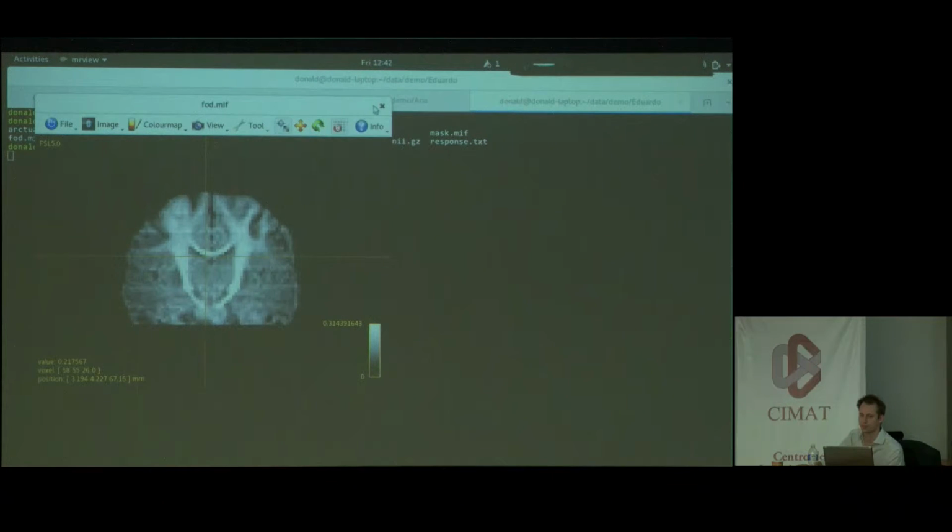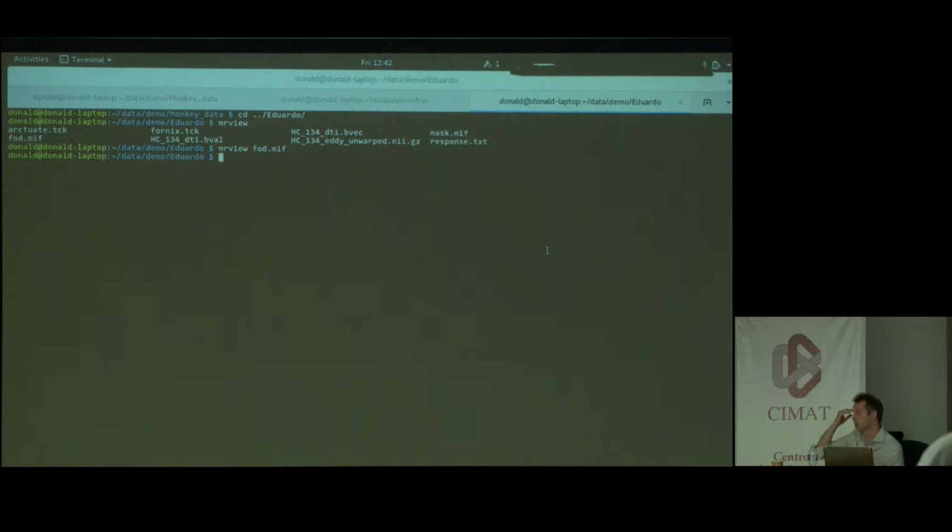Yeah, so it will change the direction, just the position to the default one. Yeah, basically. But you've still got that 2-second delay there. There's no way to disable it that I can tell. You have to go to the code. But you probably hear it when you play the sequence out. It does 10 seconds of EPI, 2-second gap, 10 seconds of EPI, 2-second gap, and you can't get rid of it. I mean, when I was trying to figure out why the data that I was getting from King's before I joined King's had this zigzag pattern to it, I actually asked them to sit in the scanner and listen just to check that that's what was going on. And sure enough, there was a problem there.